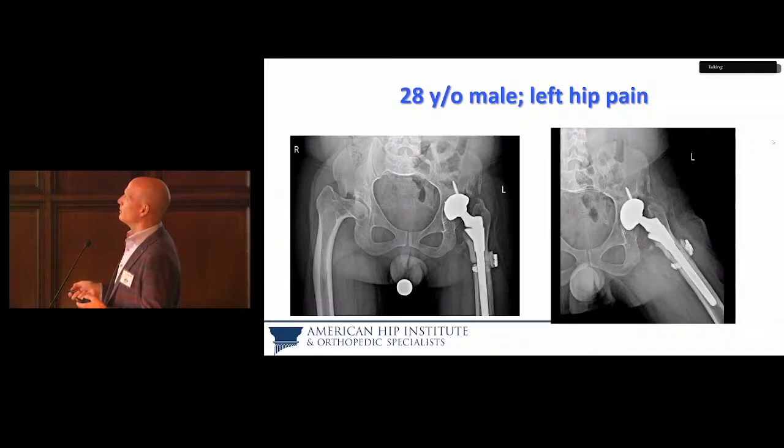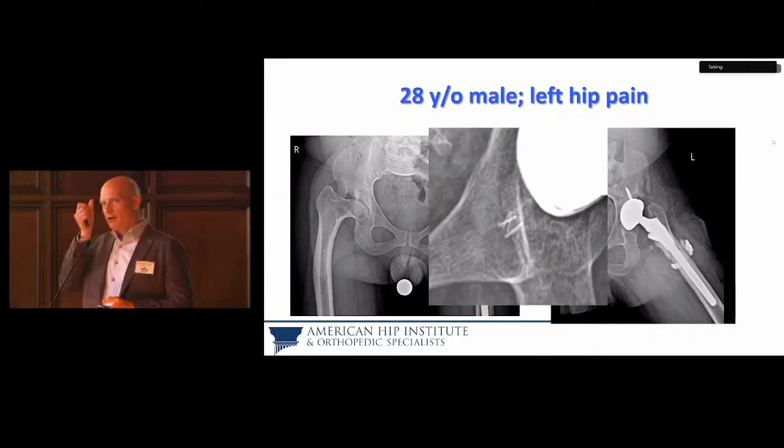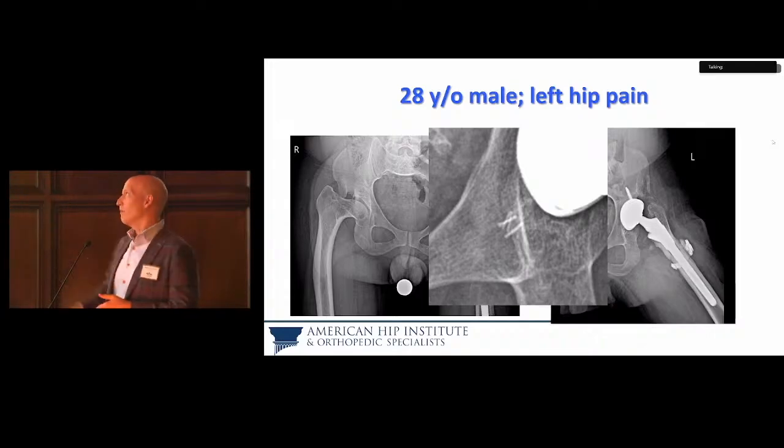But you say, oh, Mark, this is one I thought you'd critique me on. Why'd you put your cup up so high? Well, I didn't try and put my cup up so high. I actually exposed distally initially to get my cup where I wanted to be. But I ran into those vascular clips. I ran into a very big vessel during surgery, which bled a lot. So I did not want to go back in that area. And so I just put my cup higher up.